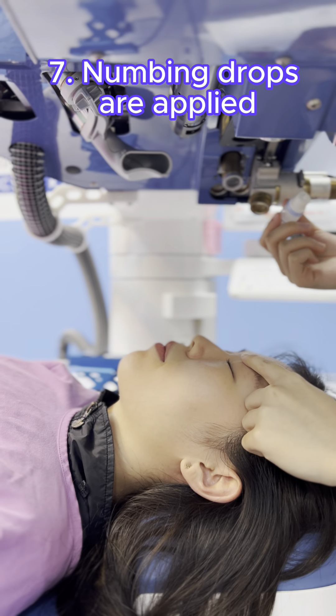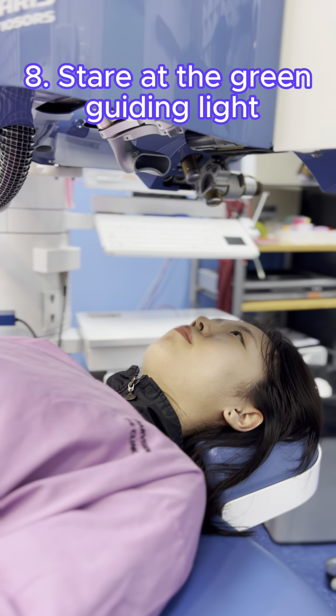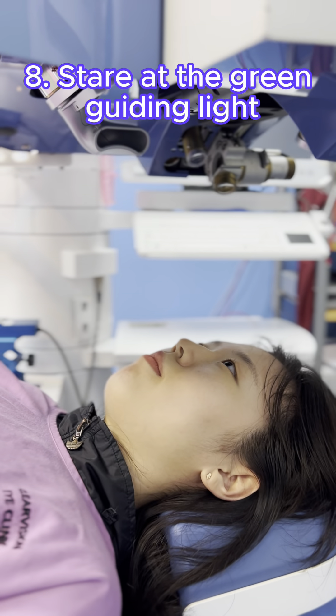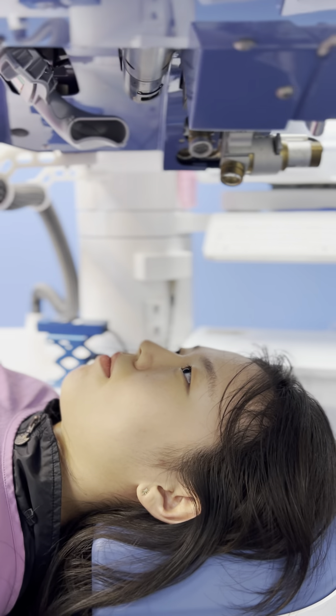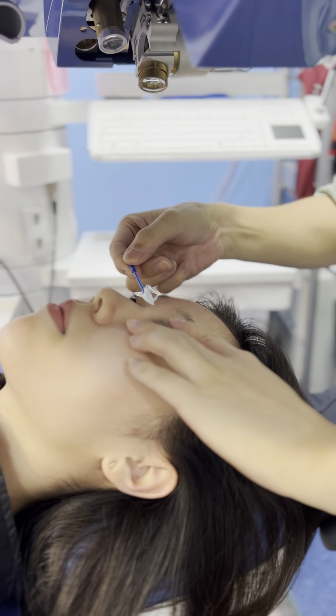Numbing eye drops are applied so that you don't feel any discomfort during surgery. Look straight at the blinking green guiding light to help prevent your eyes from moving around. A bandage contact lens is applied over your eye to protect it while it recovers.